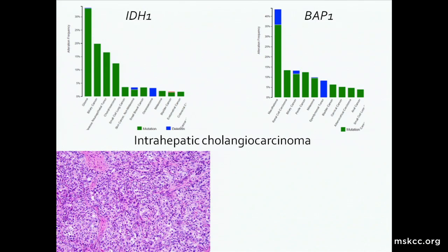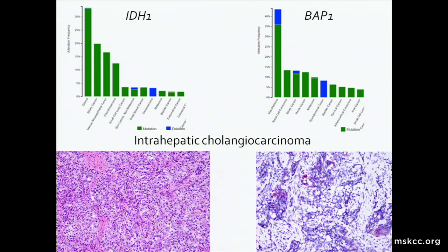and not her metastatic breast tumor. Now, we did want to confirm this by more traditional surgical pathology methods. And so we did perform albumin in situ hybridization, which was positive. Here you see these red dots indicating positivity. I'm not going to go into albumin in situ hybridization, but basically it's positive both in hepatocellular carcinoma and in cholangiocarcinoma, so you can use it as evidence that something is a primary liver tumor.